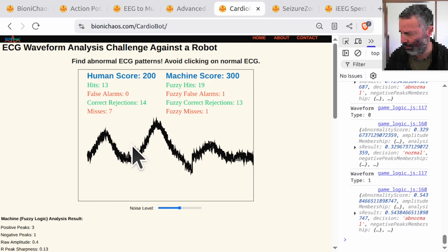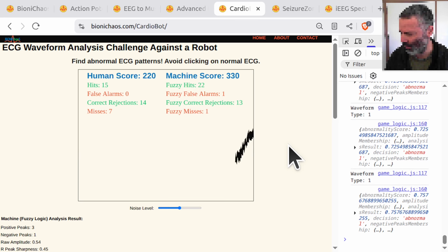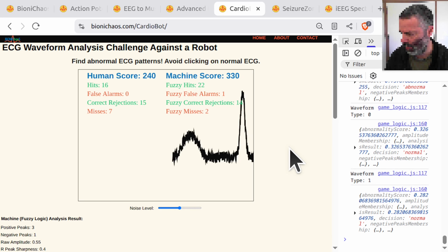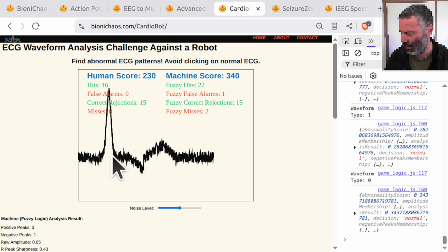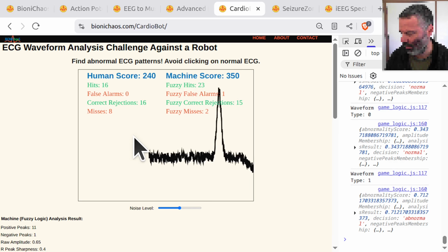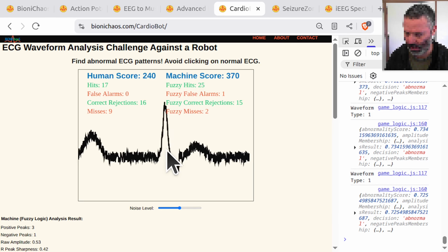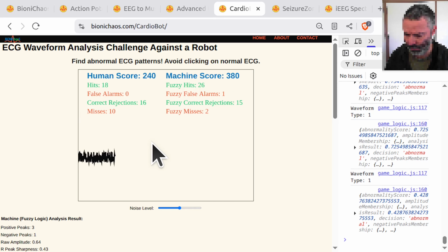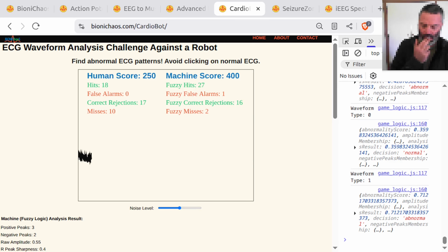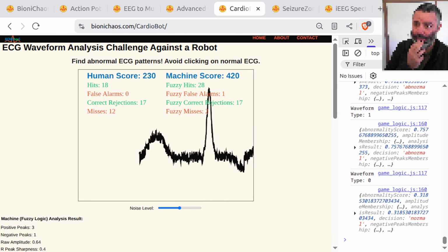It's correct most of the time. There's some sort of race condition or something. They are labeled wrongly, incorrect, or there's something else going on. We have to check. That's quite a serious bug.